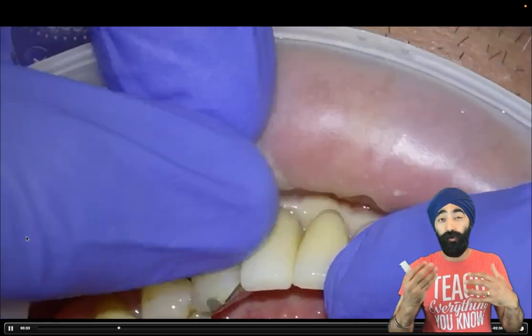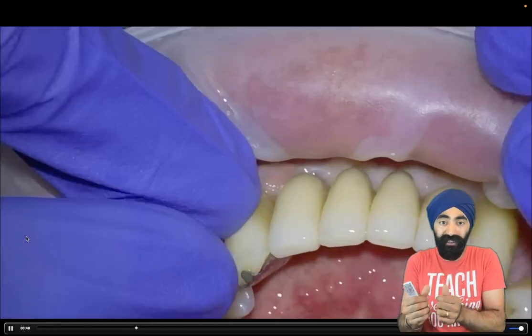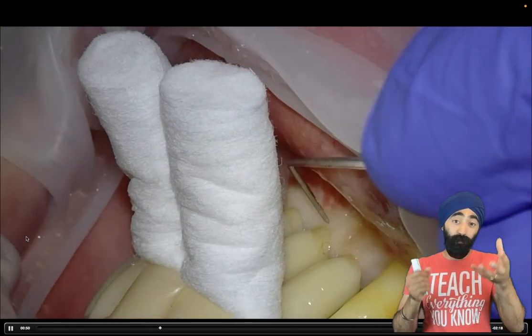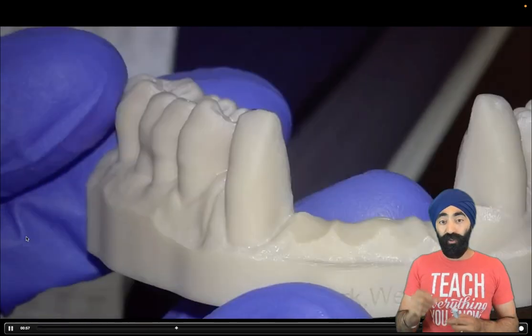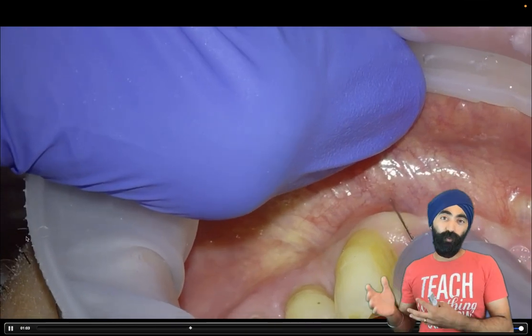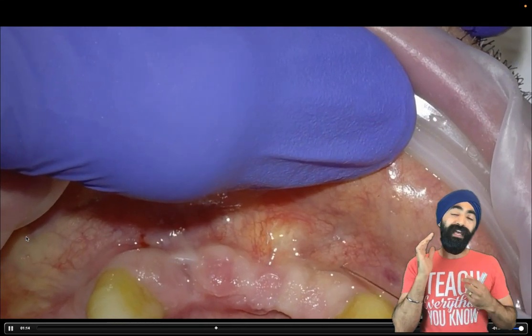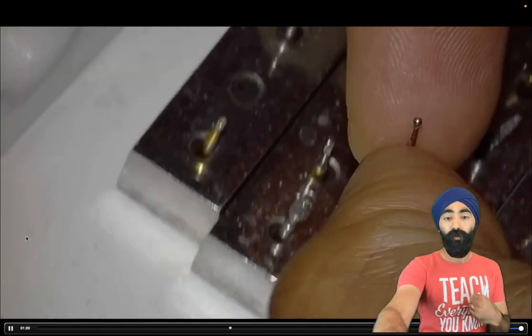There are a couple of different ways to manage this scenario when you're placing a resin bonded bridge and the soft tissue is in the way of the pontic. One way is to get the patient to bite on some cotton rolls and wait around 10 minutes. What that does is the pontics will then sink into the tissues, recreating what we have on the model. But I don't have the patience for that. Plus with the cotton wool method, will you ever know that you've got passivity? That's a concern. And once you've cemented it in place, the tissues rebound. So in that critical first 24 hours where the bond is so important, I don't want any pressure continuously coming from the pontics.